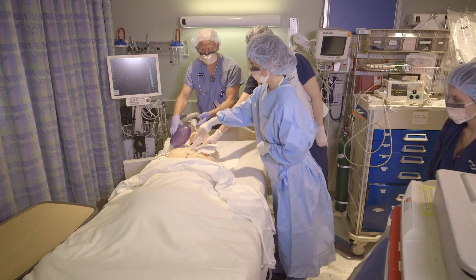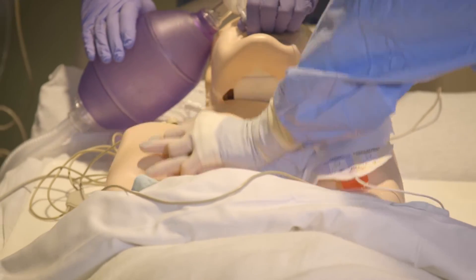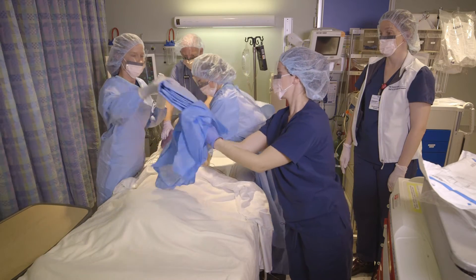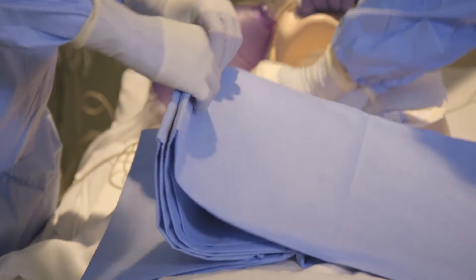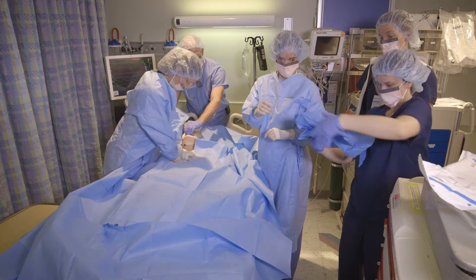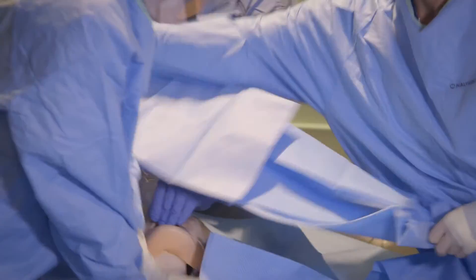After scrubbing for 30 seconds, if compressions are still needed, the sterile person will take over. While the prep is drying, the tamponade nurse hands the u-drape to a sterile person. Then the tamponade nurse will help to spread the drape open. The tamponade nurse will also hand the half-sheet drape to a sterile person, placing it over the patient's head and shoulders.